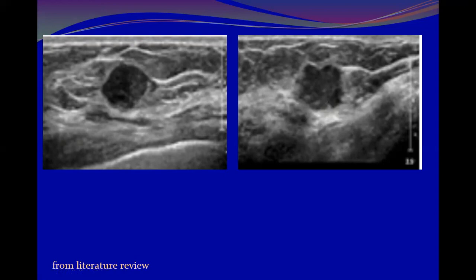Yes, a difference in the angle, I think. What does it mean, the difference in the angle? I took the probe perpendicular, and then I took it at another angle. Okay, so you mean the scanning technique of the lesions.